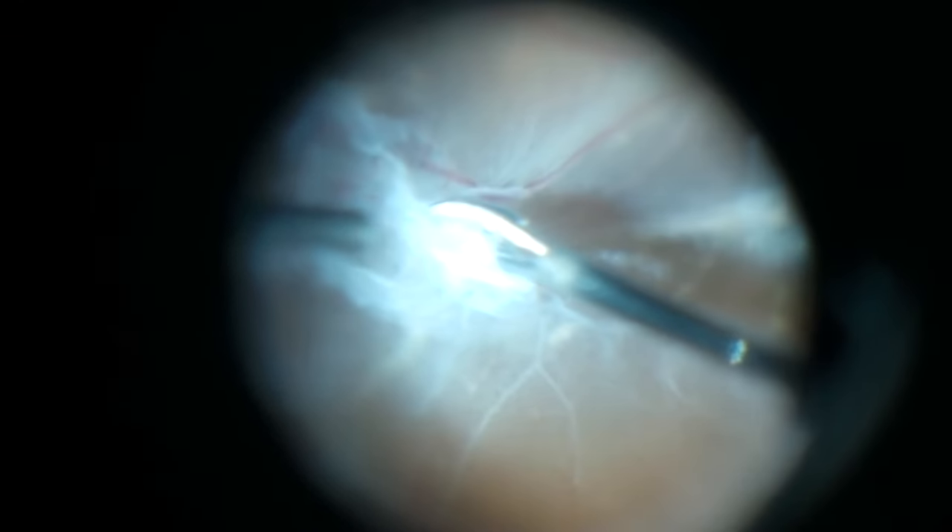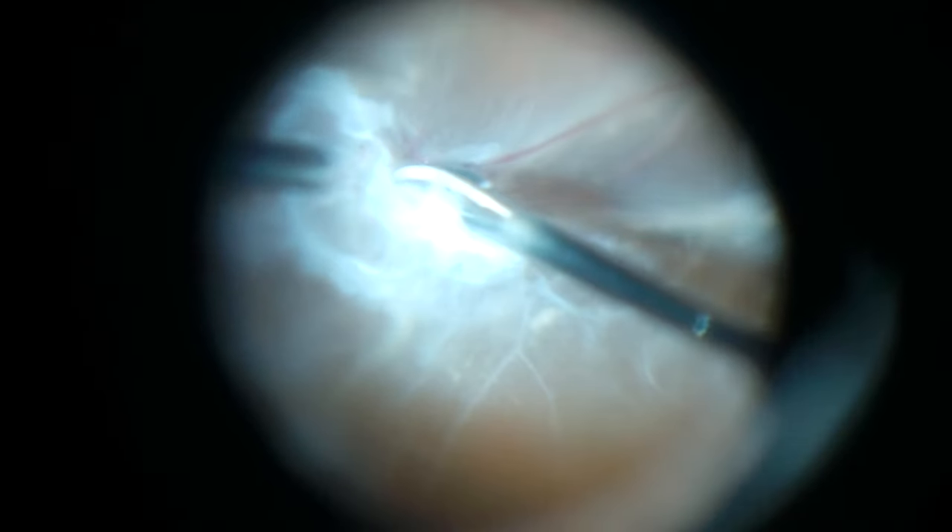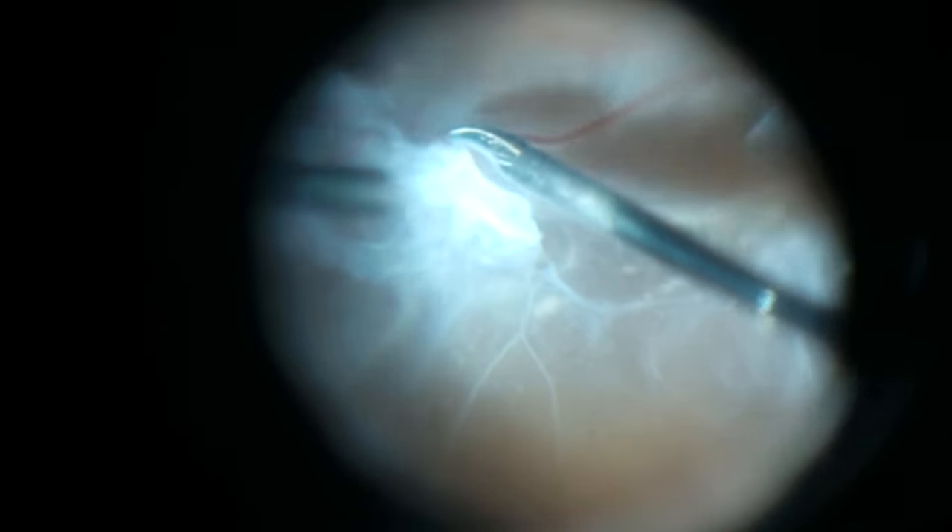I think it's important to remove the traction that's close to the macula. The areas in the periphery I don't think are as critical to be removed, and therefore you'll see in this case there is one fairly large plaque in the peripheral retina that I leave, and the patient doesn't suffer because of it.